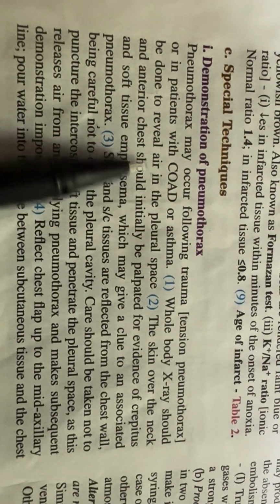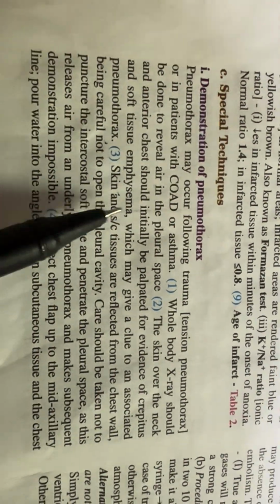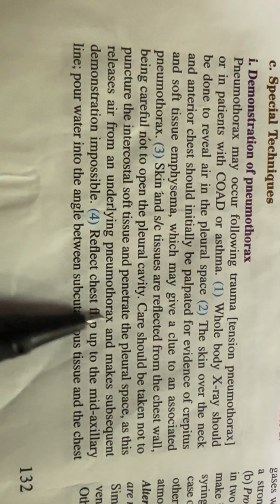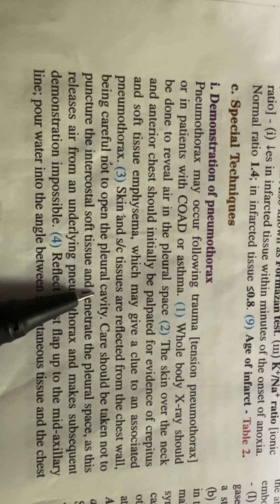The skin over the neck and chest should initially be palpated for evidence of crepitus and soft tissue emphysema, which may give a clue to an associated pneumothorax. Skin and subcutaneous tissues are reflected from the chest wall, being careful not to open the pleural cavity.